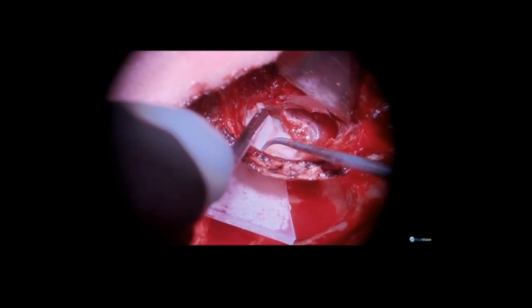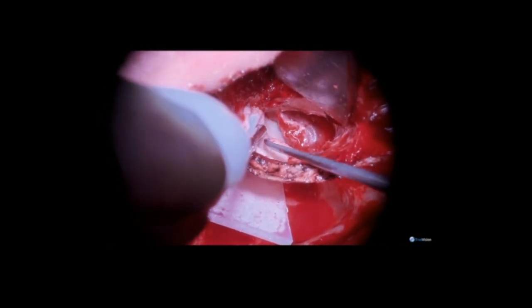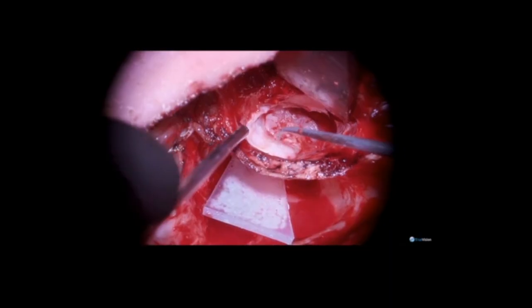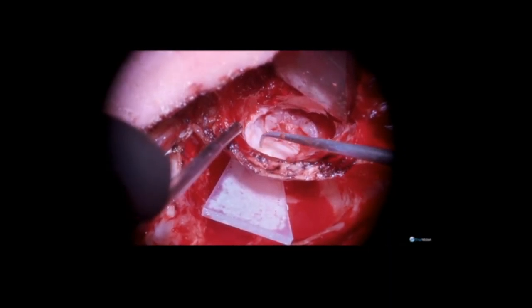This serves as a very strong and stable reconstruction to prevent further reformation and re-retraction. This construct will also support the prosthetic that will be placed in the second look and ossiculoplasty phase in order to minimize extrusion.